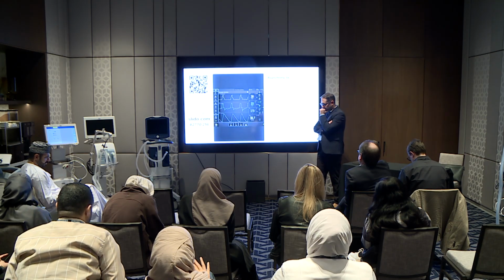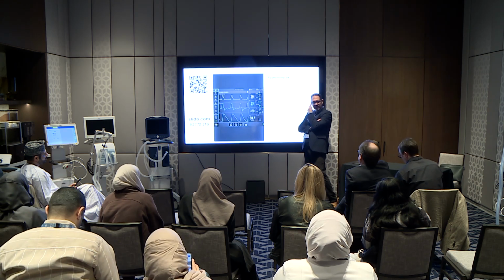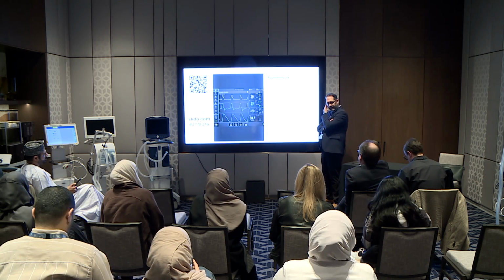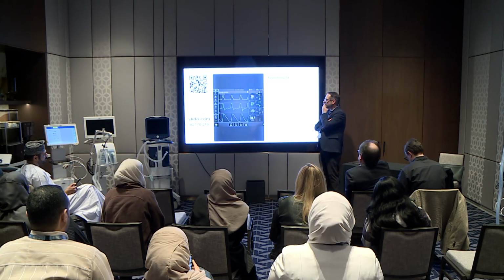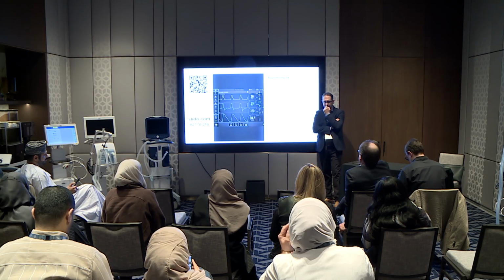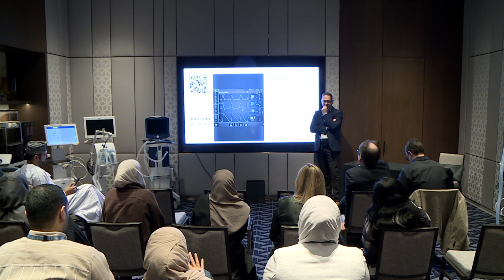Now, one of the things I mentioned earlier about ineffective efforts is that they can't trigger one breath, but what normally happens on the next breath? They can trigger again. Usually, like every other breath, they can trigger. I'll just point out, do you see any triggering? So remember, the first thing you always look for is probably triggering.